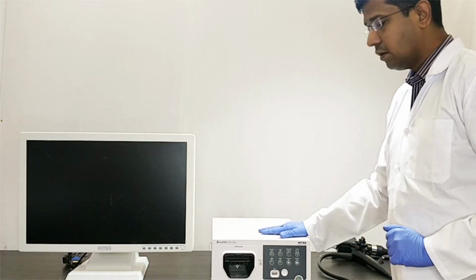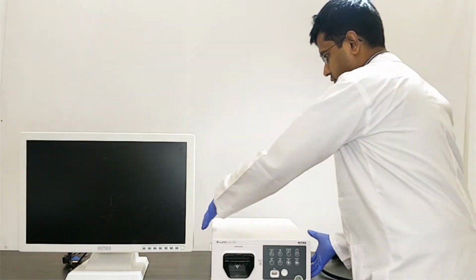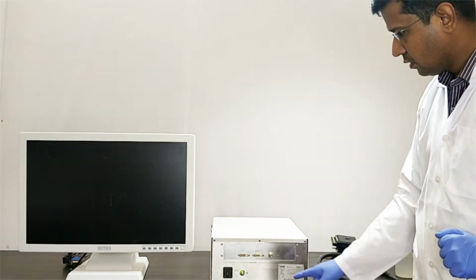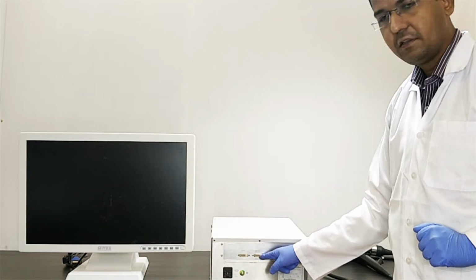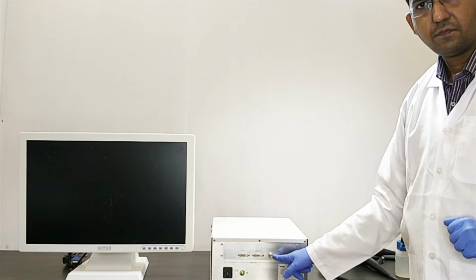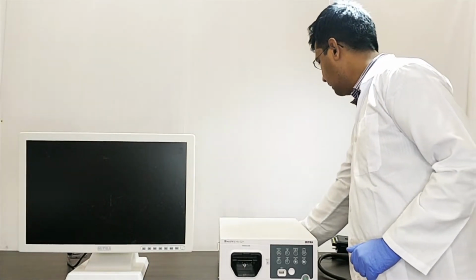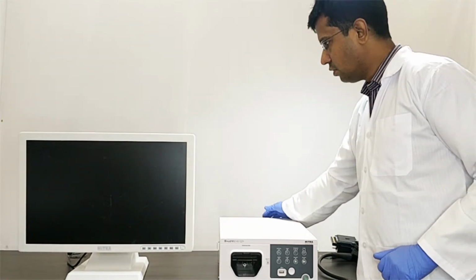Now we see the connection of this video processor. This is the rear panel of the video processor. It has the power socket. There are 2 DVI-D signal connections, 1 HD-SDI connection, and 1 remote control socket for calibration purposes. So I have done the power supply cable connection and video signal cable connection.